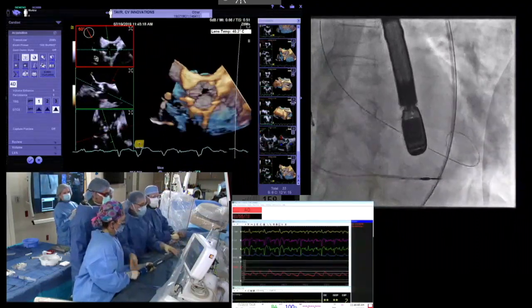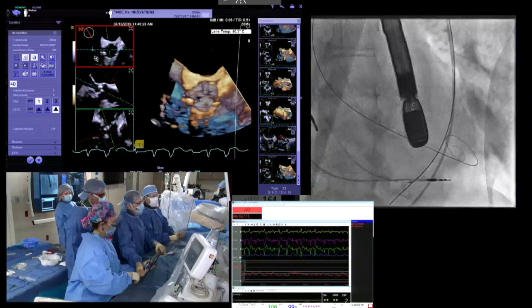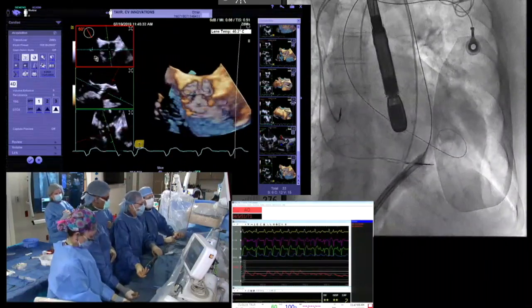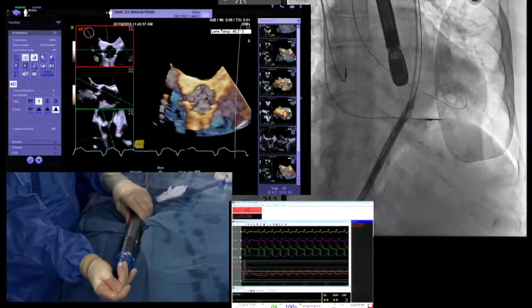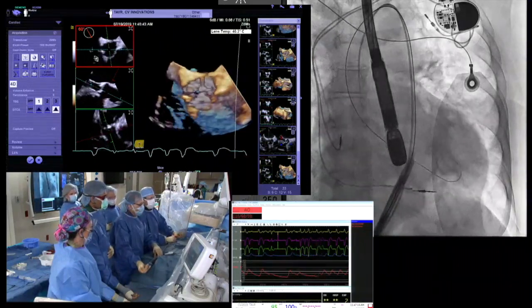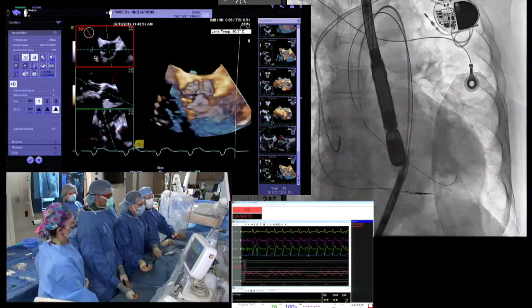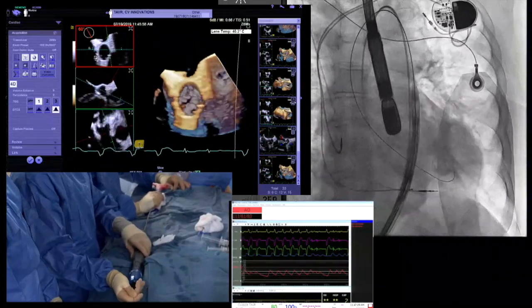So as you push this valve in, there's a lot of energy and wire manipulation. You have to pull back a lot because of the stiffness of the catheter at first. So it's definitely a two-person, talk-to-each-other kind of procedure. Bob, describe what you're doing now with that center marker there. First of all, you have to have the catheter super lubricated to advance it. And in the middle of the valve here, there's a mid-marker that will correspond to the top of the adaptive seal. As we advance around the arch, we want that to be on the lateral aspect or greater curve. And I have to advance and twist at the same time so you can see the marker on the outside.